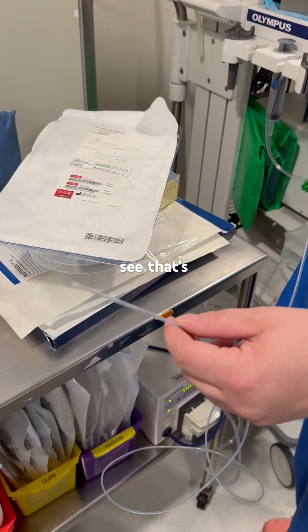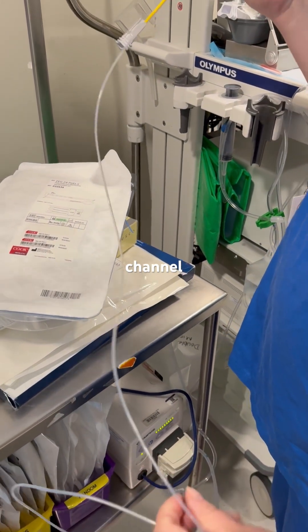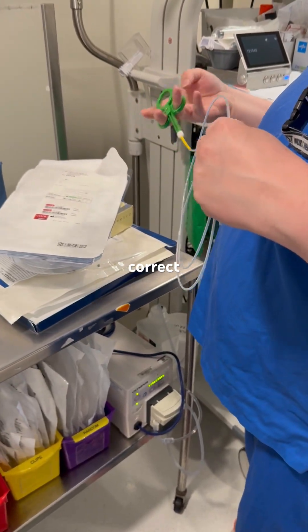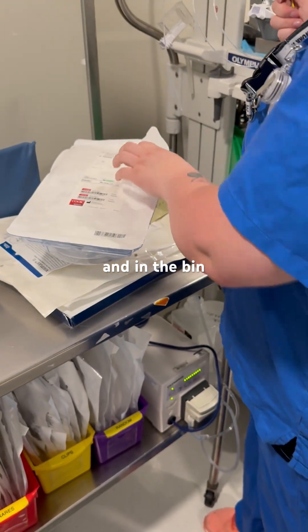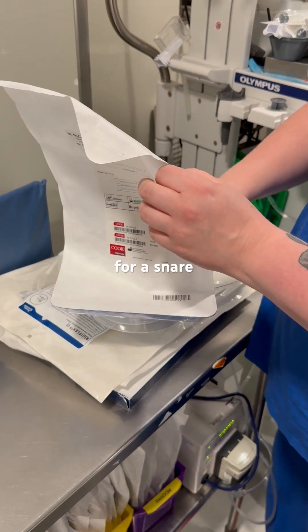Thank you very much. Excellent. Easy to use. It goes down the biopsy channel. It is not reusable — correct, one and done, and in the bin. That is our quick how-to for a snare.